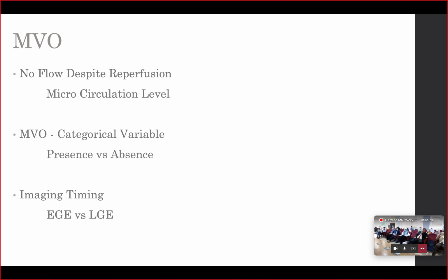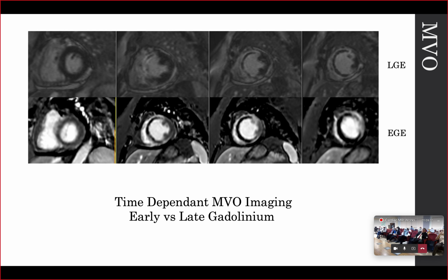Early enhancement or late enhancement. So we have what's so-called early MVO and what's so-called late MVO. Early enhancement is usually 1-2 minutes after giving the contrast. Late enhancement is after 5 minutes of acquisition.